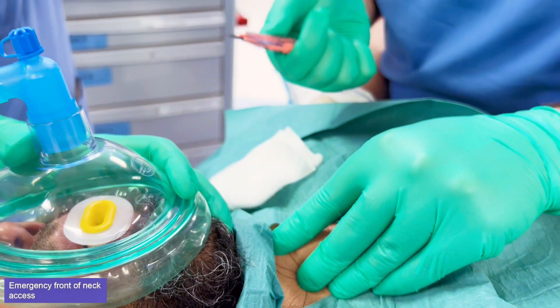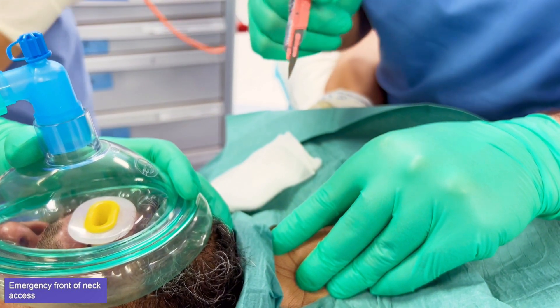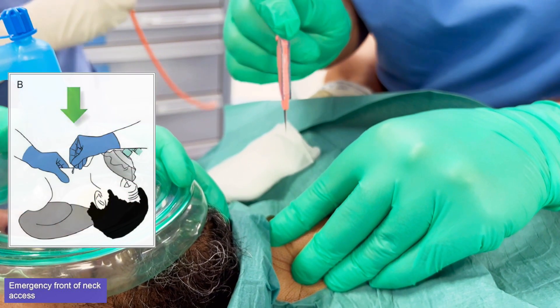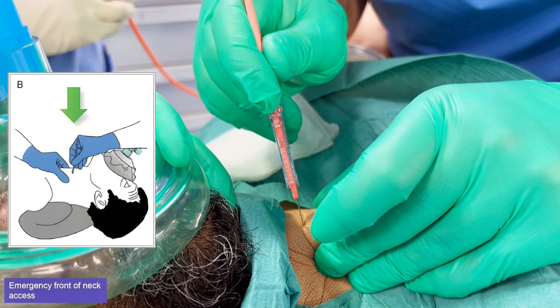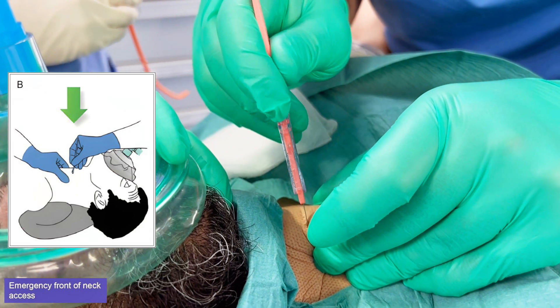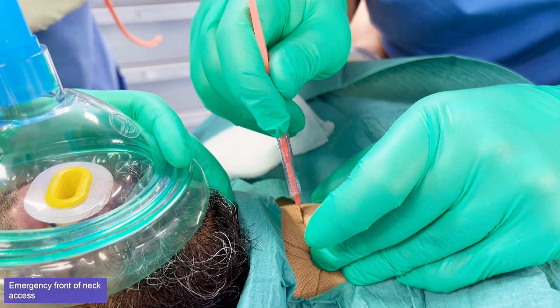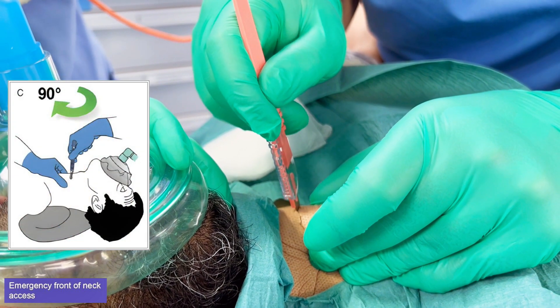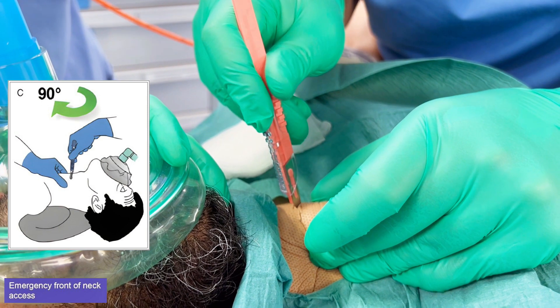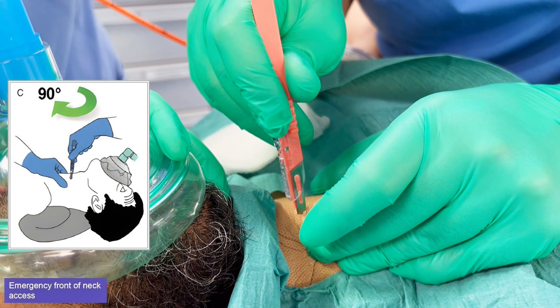Hold the scalpel in the right hand, making a transverse stab incision through the skin and cricothyroid membrane with the cutting edge of the blade facing towards you. Keep the scalpel perpendicular to the skin, then turn it 90 degrees so the sharp edge points towards the feet.